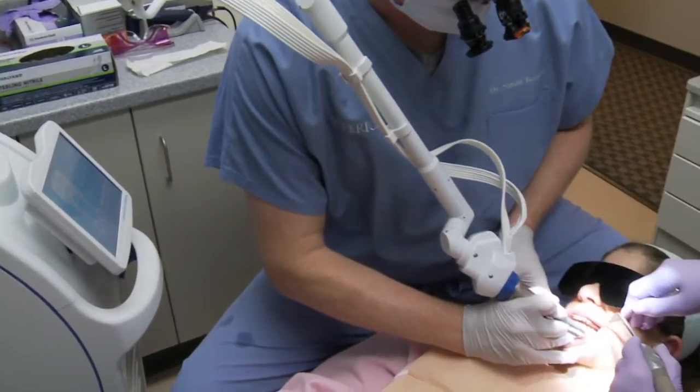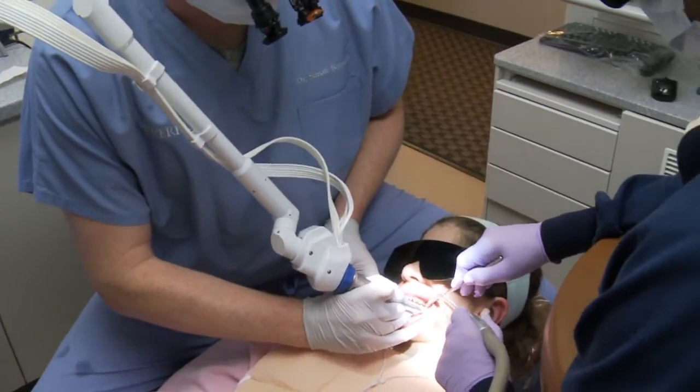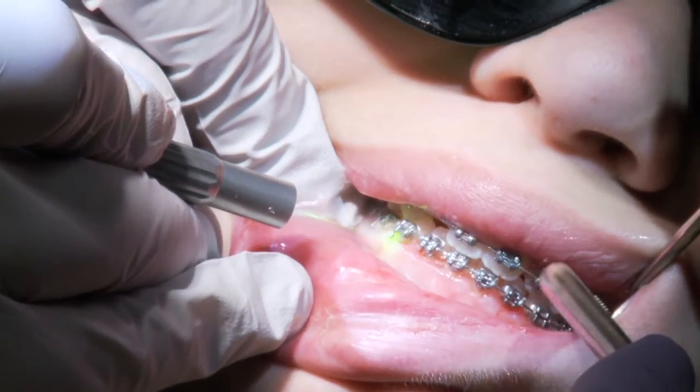What I explained to the parents was there were two ways to do it. We could do it the traditional way — go through with a scalpel, numb up the patient, incise the tissue and remove it. But the advantage to the laser was we would use very little if any anesthetic, no sutures because the laser cauterizes the areas, minimal bleeding, and faster healing time with better recovery.